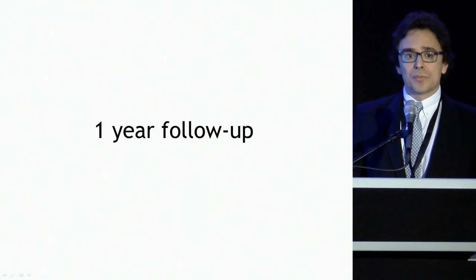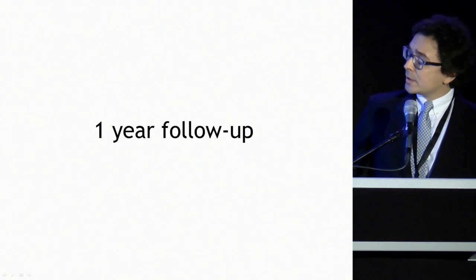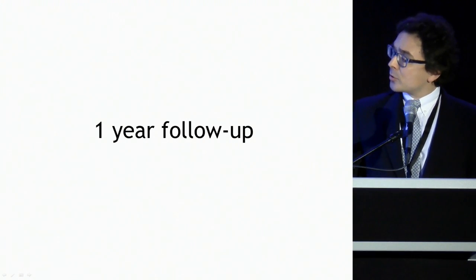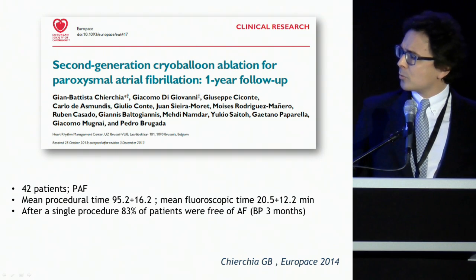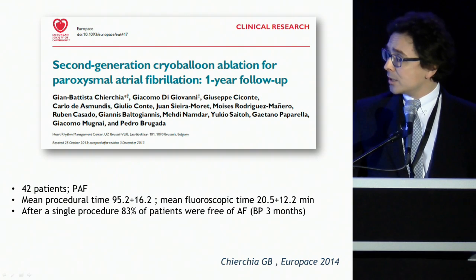So what about 1 year follow-up? What can we tell our patients when you propose a cryoballoon ablation to them? So this was, I think, the first study that came out from our group on 1 year follow-up. We analyzed 42 patients with paroxysmal atrial fibrillation.